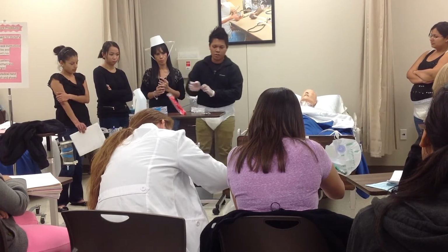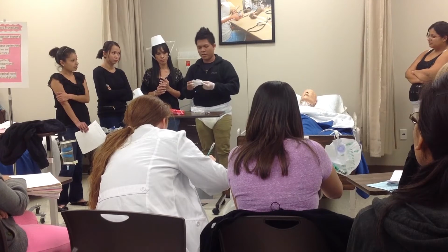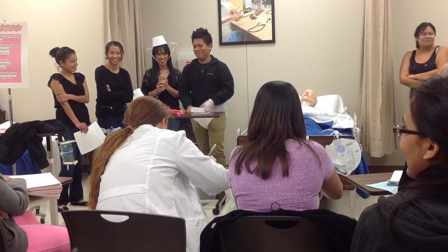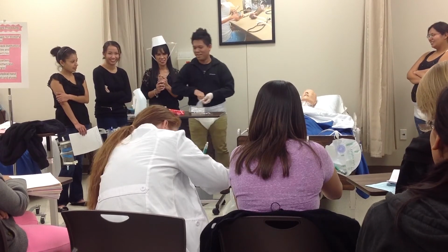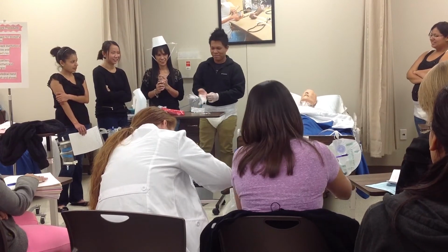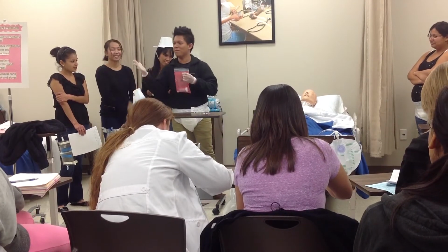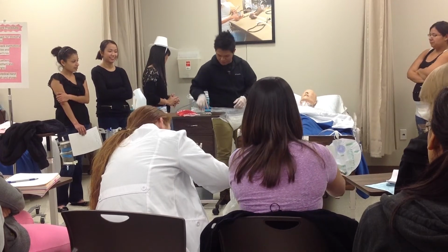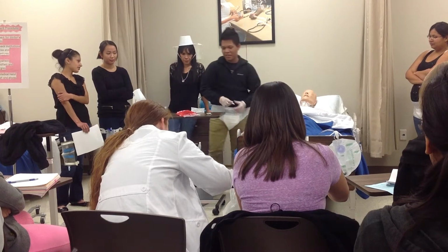Okay, take your gloves off. Oh yeah, that's right. Just pretend that we have it on. Okay, rewind. Alright. So I already had the specimen in the bag and everything. So we're gonna go ahead and clean the port, inside and out, so we already cleaned that up.